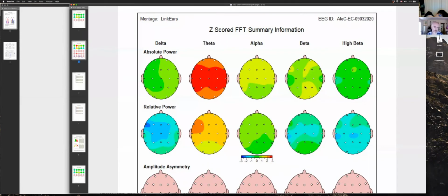It's only one standard deviation. So about a third of people in the world will have this pattern, right? Because it's only out here in the bell curve. But here's some guesses.